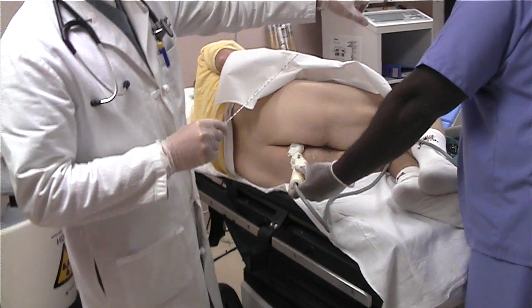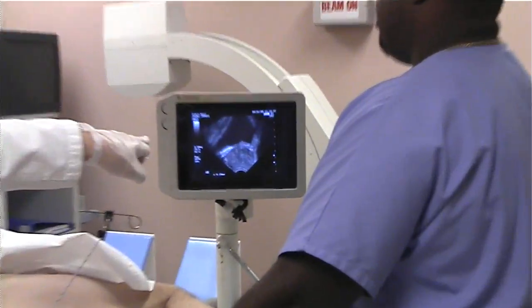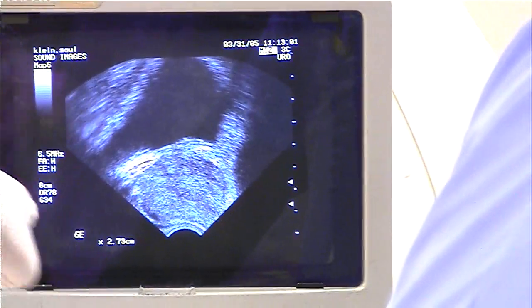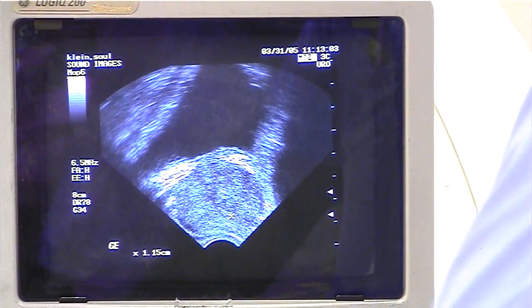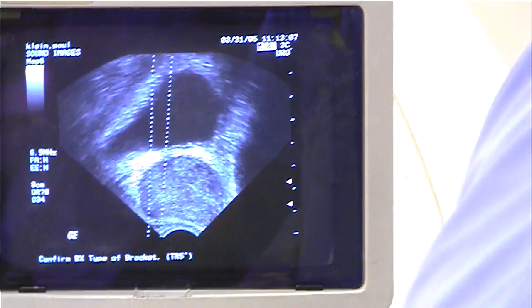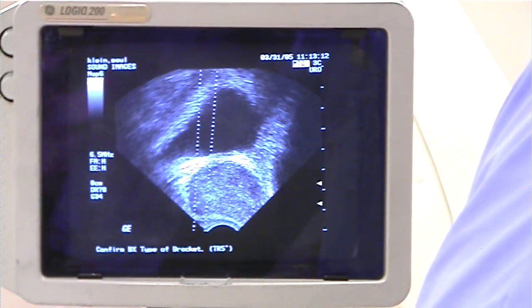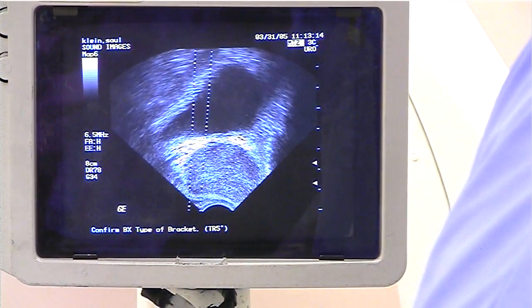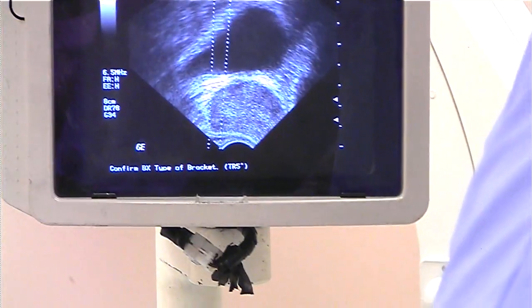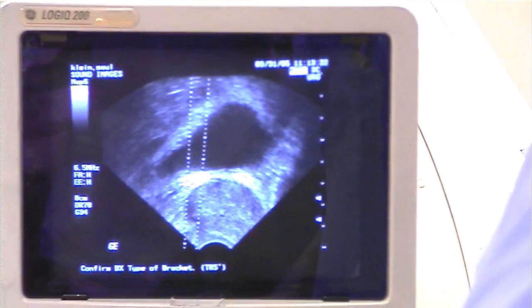Now what we're visualizing here — I don't know if you can see that very well on the screen — but we can see the prostate. We're looking at it in sagittal dimension here. So we'll just put the needle in here. We'll start at the base. We aim just a little more towards the base, MJ. I like to put that top marker right at the top of the base.